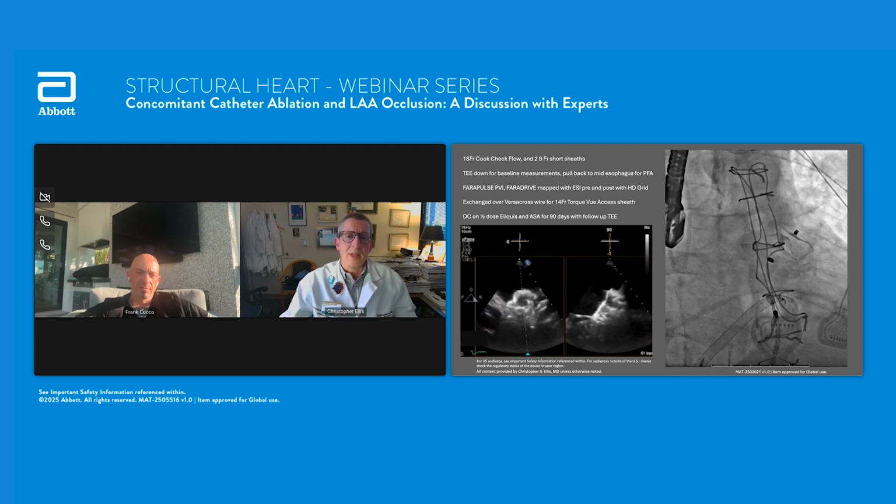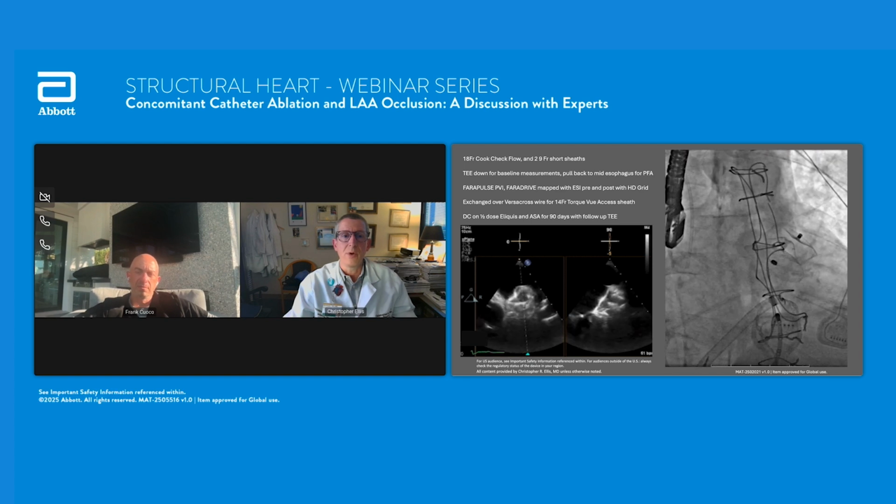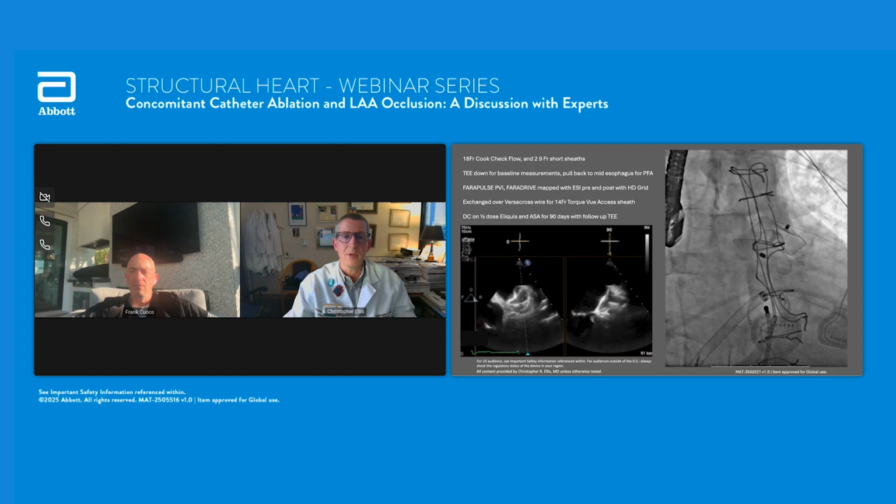So my question to you on this then is, if you're going to do right atrial ablation first, what's your transseptal puncture process? Have you already dropped a sheath into the LA and it's just sitting there on the sidelines, or are you using some kind of combined tool with the Agilis for transseptal?